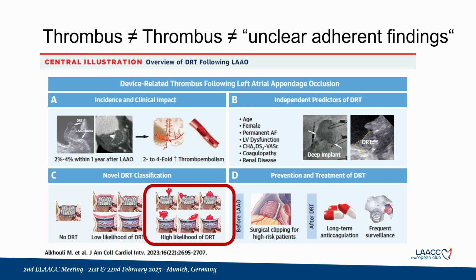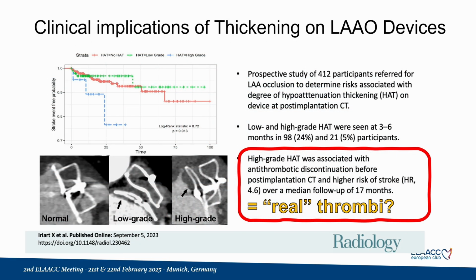So if you look at the predictive factors, we have a couple of clinical factors. I mean, this is something we can't rip off. So obviously, the only thing we can really influence is the implantation depth of the device. This is something we have to keep in mind that this can help. And this is also something you have already seen. So if you have the grading and if you have a thrombus layer, because there's a gray zone in my eyes in between a real thrombus and this endothelialization, which should be just one layer.